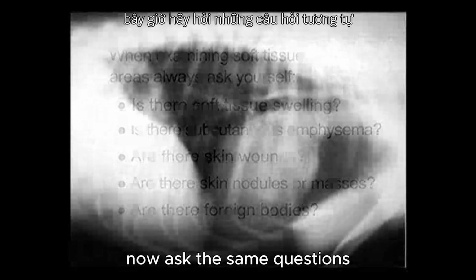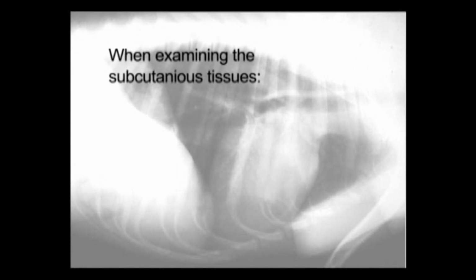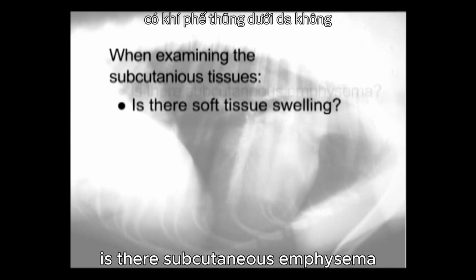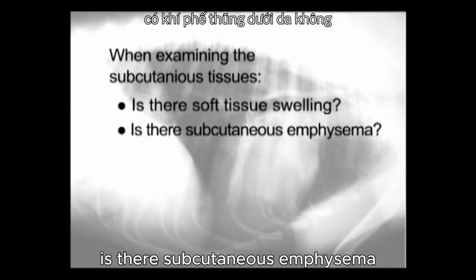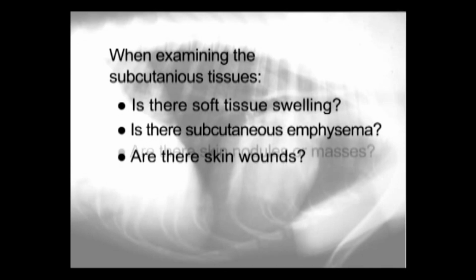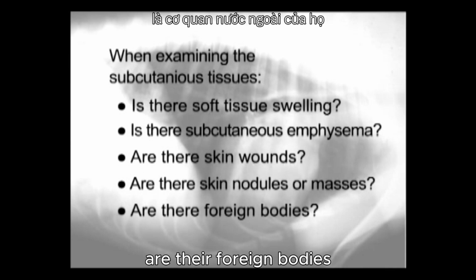Now, ask the same questions when examining the subcutaneous soft tissues. Is there soft tissue swelling? Is there subcutaneous emphysema? Are there skin wounds? Are there skin nodules or masses? Are there foreign bodies?